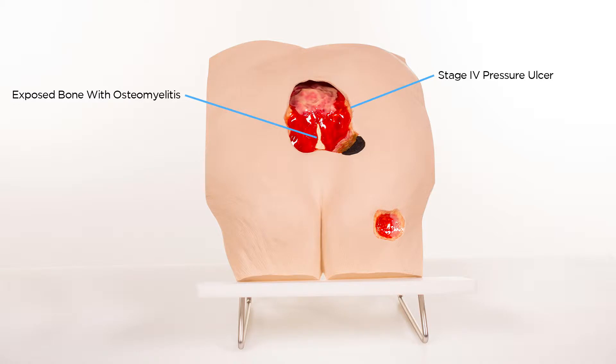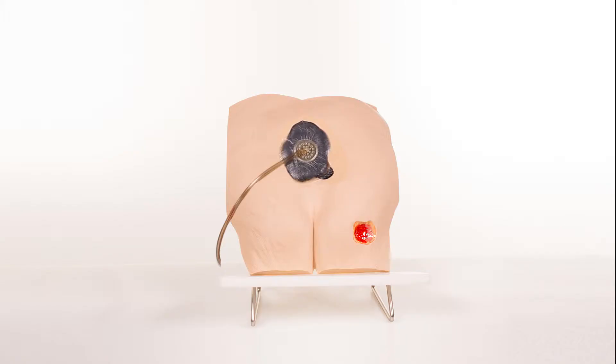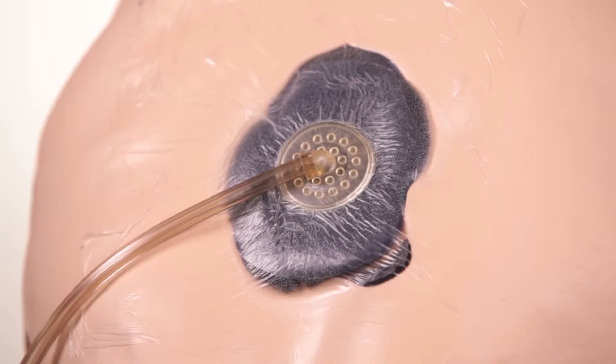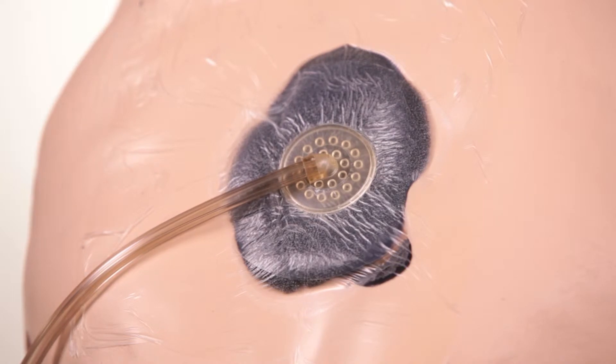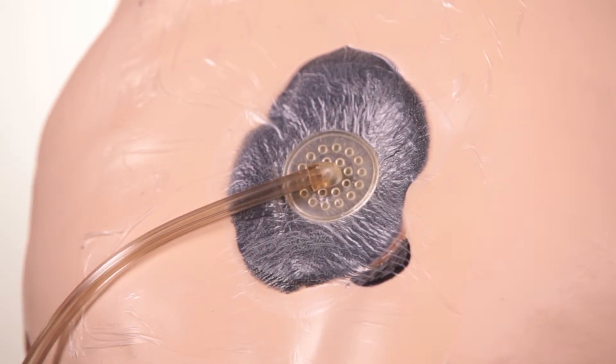Just below the Stage 4 on the right side of the model is a Stage 3 pressure ulcer. The Stan Stage 4 Pressure Ulcer Model is made of a unique material that permits the application of negative pressure wound therapy dressings. This can be done on the Stage 4 as well as demonstrating bridging between the Stage 3 and Stage 4 due to the close proximity of the two wounds.